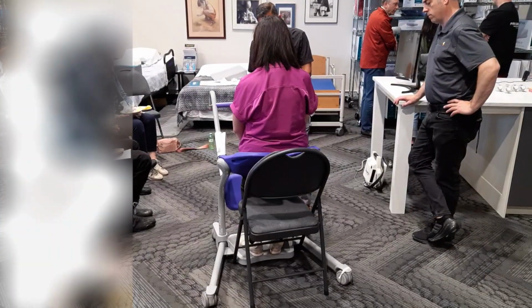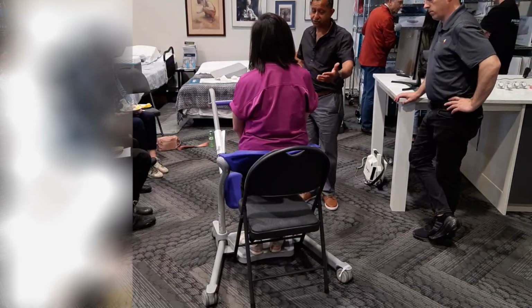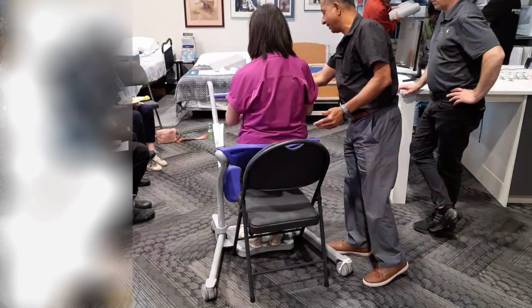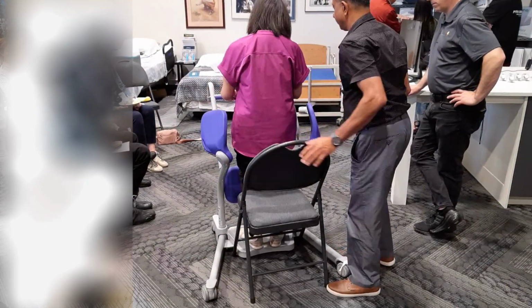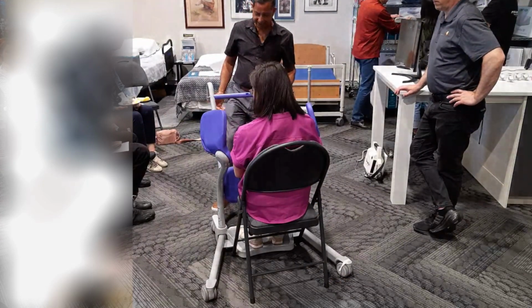So if, let's say, I'm transferring you onto a dining table or dining chair, or you're in the bathroom, I'll ask you to grab the handle again and stand up. I'll pull this apart and you have a seat. So you got your transfer done.